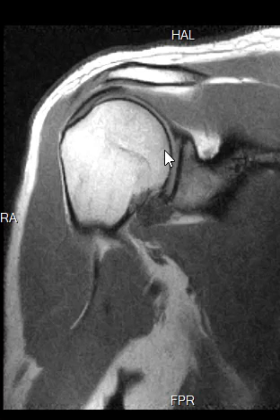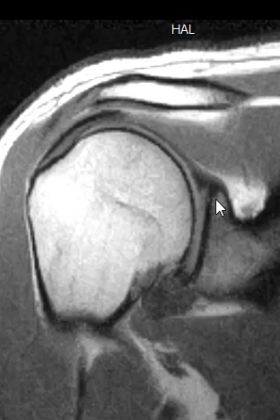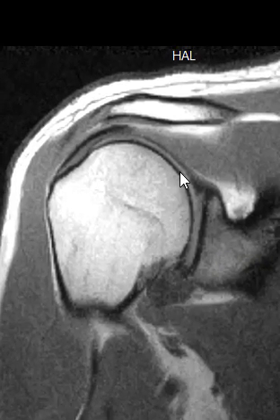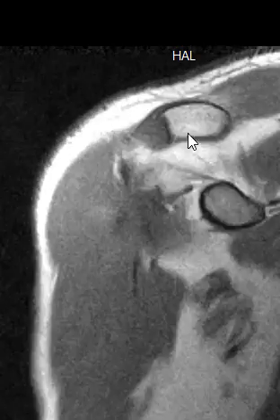Your humeral head is nice and round and it sits in a cup here called the glenoid, so this makes your shoulder joint — the round humeral head and this cup. Around the periphery of the cup there's a little black wedge we call the labrum, right there, this little triangle. The labrum goes all around the periphery, around the ring of this cup. The glenoid is your shoulder joint, and it looks great — there's no arthritis, no spurring.